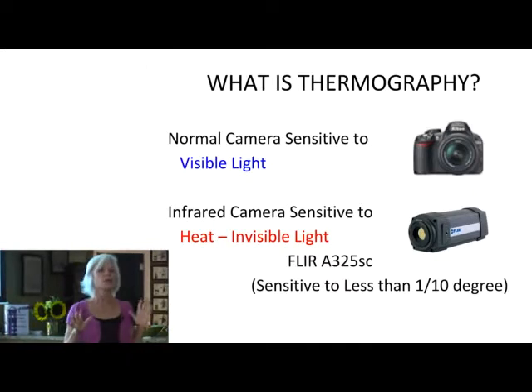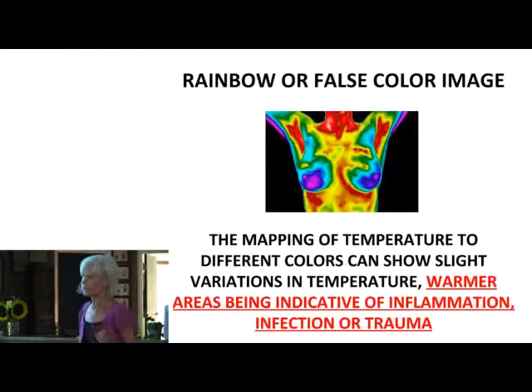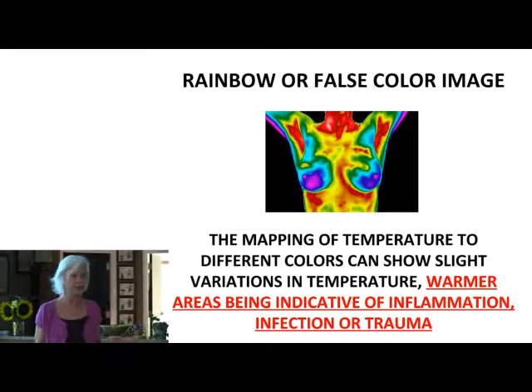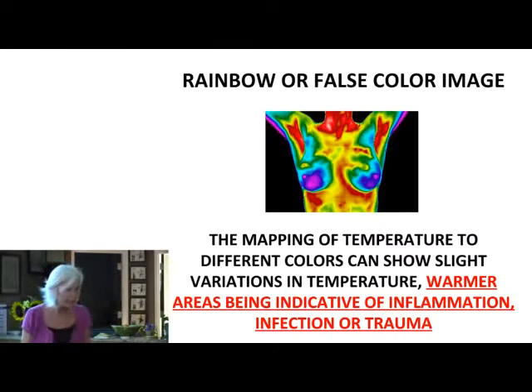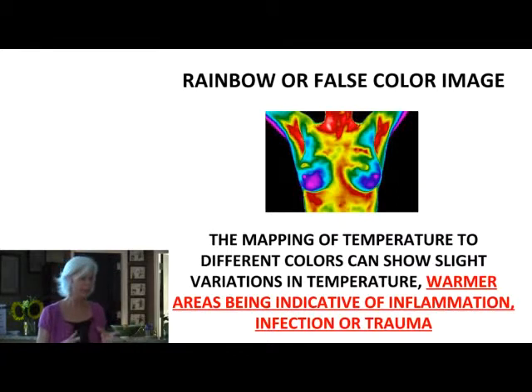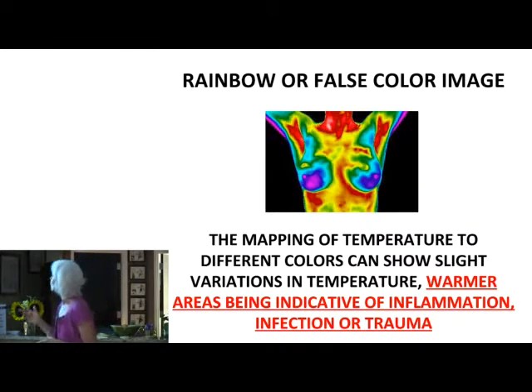Okay, so why do we measure heat? Effie, you can go to the next one now. We measure heat because we can pick up with thermal imaging any significant areas of heat within the breast. Unlike the other screenings that we're familiar with, mammography, ultrasound, MRI, thermal imaging picks up heat. And heat can tell us one of three things.